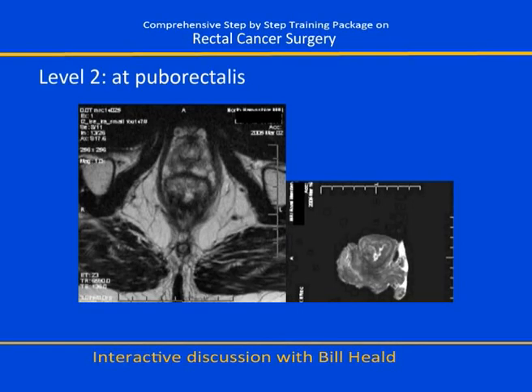As you know, to butt in, I'm passionate about following the nerves down and the anterolateral aspect of that plane, where the levator diverges slightly away from the internal sphincter. That's where, adjacent to the puborectal sling, the neurovascular bundles are particularly vulnerable during an APE operation, and for that matter during an ultra-low anterior resection.